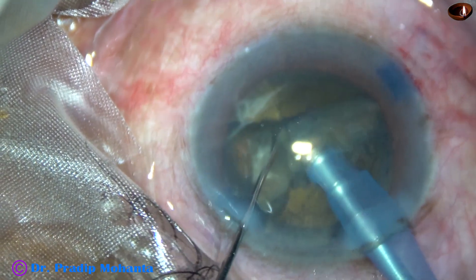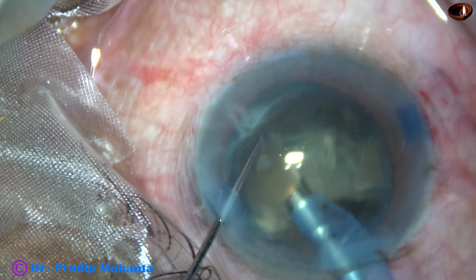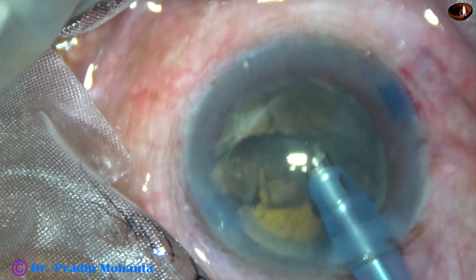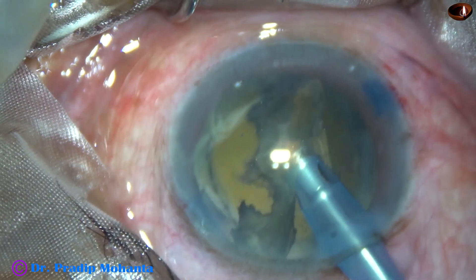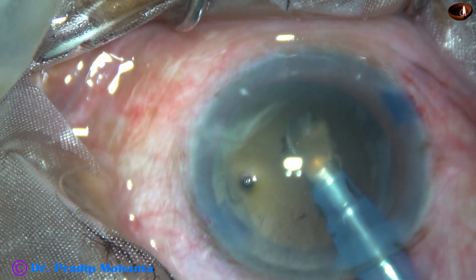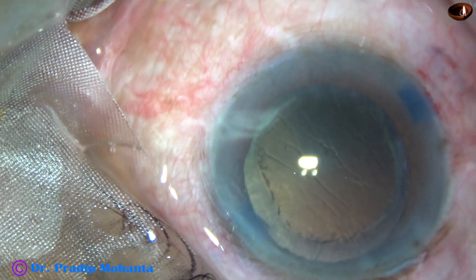A little brownish tinge can be seen in the nucleus. Now we can see the white reflex — sometimes white reflex, and when the eyeball tilts, we see occasionally red reflex. The microscope is Topcon M800. It's a good microscope, but it doesn't have the stereo coaxial system like Lumera. So we don't get a very good red glow, but whatever glow is obtained is okay for cataract surgery.